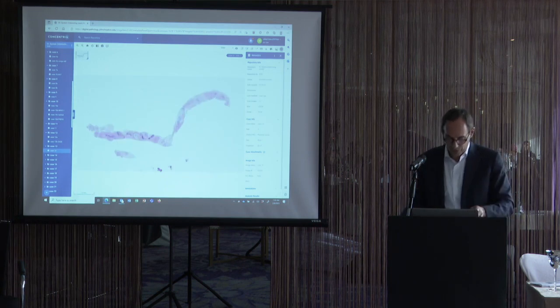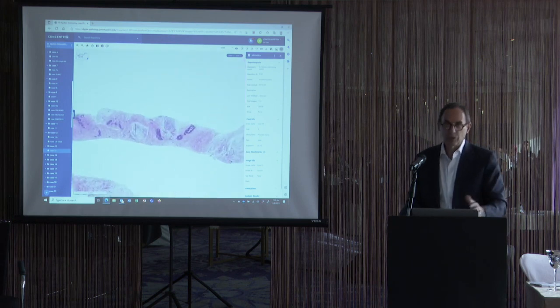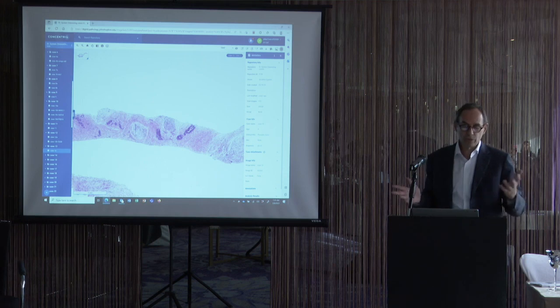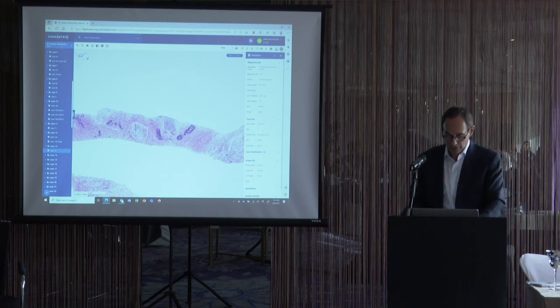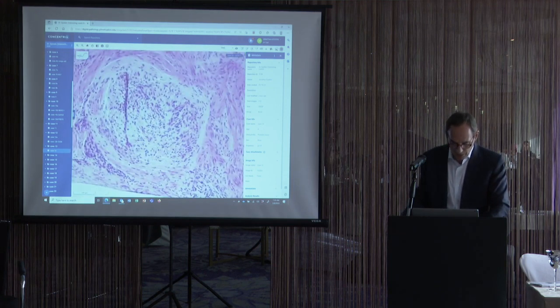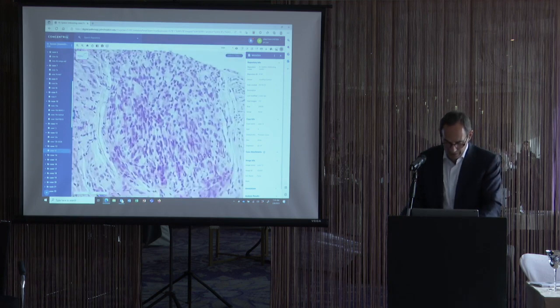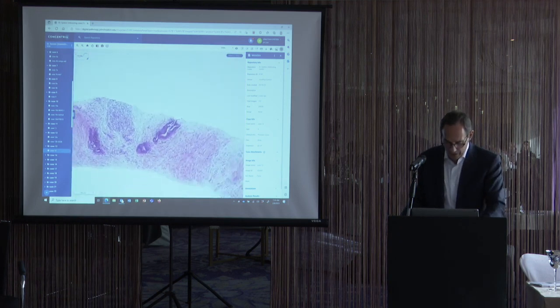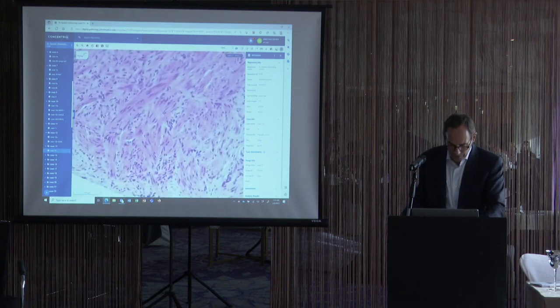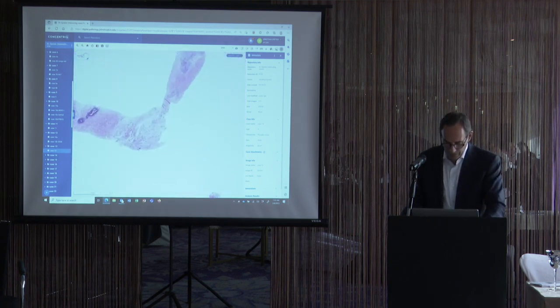This is just a really weird case, but it was a fun case, so I thought I would show it. It's a prostate needle biopsy in a 9-year-old. So, who's getting a prostate biopsy at 9 years old? This was for a boy who had a big mass in his prostate, and what we can see are these little nodules that are little spindle cell nodules and myxoid there, another one there. Even over here, it starts as another little nodule, another one.